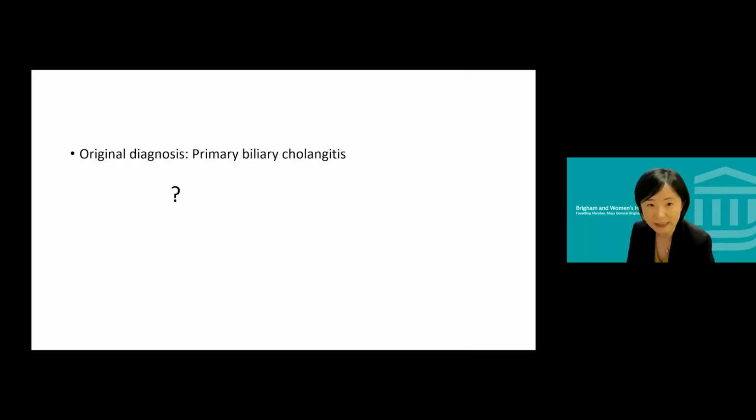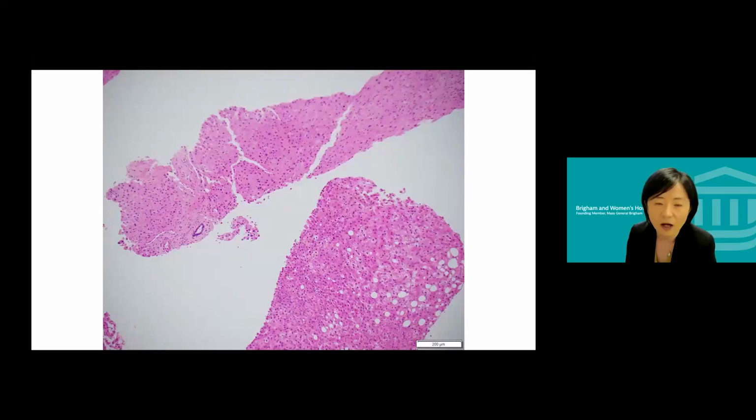So let's look at the case again more carefully. Although most fragments are very similar, there was one fragment that does show a normal portal tract with a portal vein, a bile duct, and then the hepatic artery next to it. And then the fragment below that core looks very similar, but it does have a slightly increased level of steatosis and a mild lobular inflammation, somewhat increased density of nuclei, and a more eosinophilic staining quality of the hepatocytes.